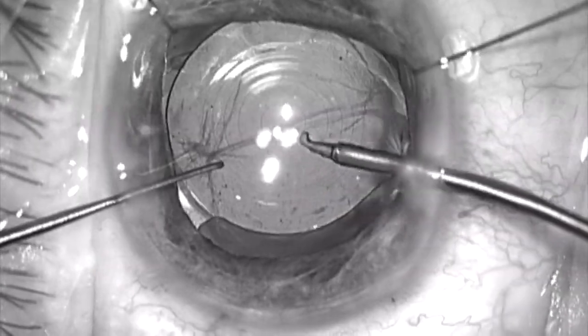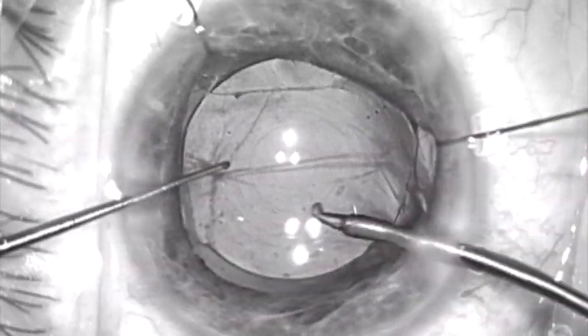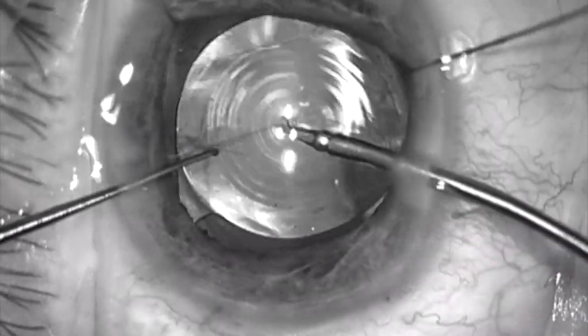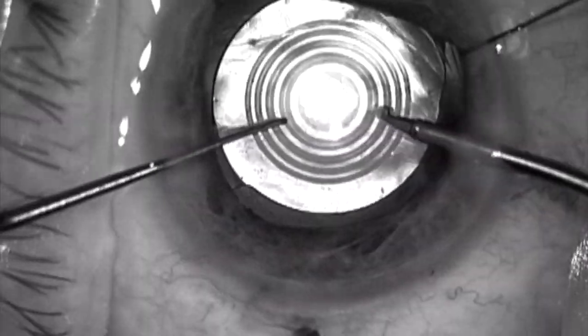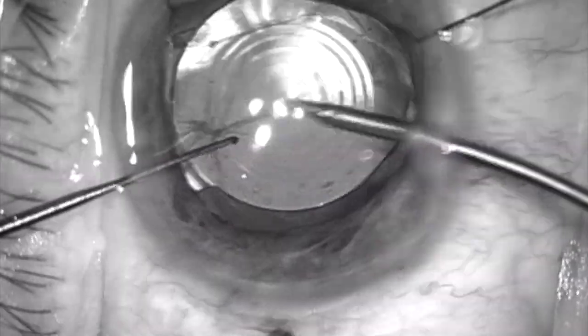I'm a little bit off of that — maybe about 15 to 20 degrees. But it's only a T3 lens, so that will only leave about a diopter of astigmatism, which I can correct at the slit lamp if I need to using a slit lamp LRI.